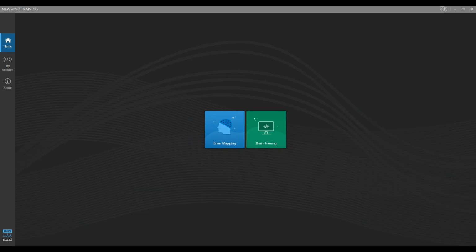That way, it's kind of like how when we train high beta down, the default is 90%. We're just trying to lightly reinforce that, but we're not trying to heavily train it like other frequency bands that we may have set at a 75% target. And just by bringing those two thresholds up, we may see an improvement in the training efficiency, because now their brain really only has to focus on the 2 to 7 down. So we're just kind of easing up on them.